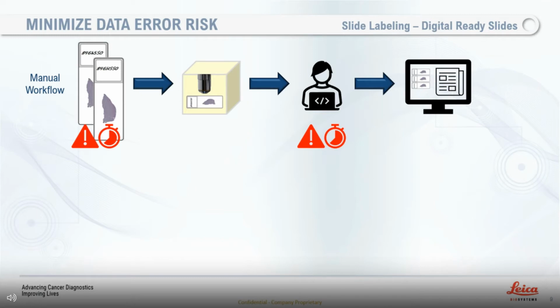And with any data entry, it's going to be time consuming and it's another job to be done manually. And it's also going to be inherently prone to keystroke errors. Ultimately those two pieces together then lead to potential errors within that final aggregated slide and data set that you have.